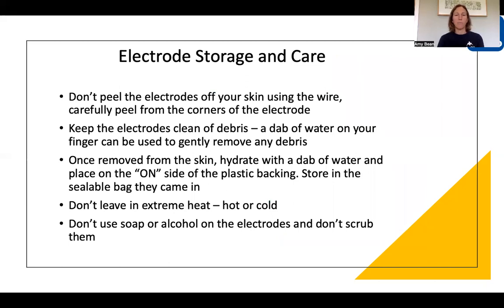To look after your electrodes and make them last as long as possible: when you peel the electrodes off your skin, don't peel using the little wire attachment — carefully peel from the corners. Try and keep them as clean as possible. As soon as they're removed from your skin, give them a small dab of water to remove any debris or skin, then put them back onto the plastic backing. That dab of water also keeps them hydrated, which is really important, and it's a good habit to put them back in the sealable bag as well.